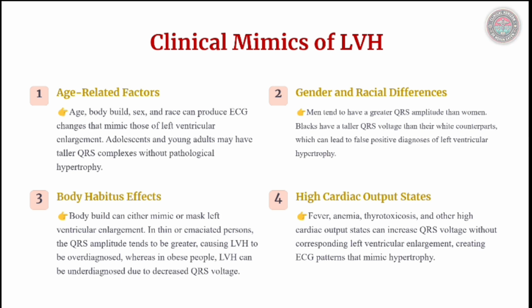Clinical mimics of LVH. Certain non-pathological conditions can mimic LVH. Young age, male gender, and Black ethnicity are associated with naturally higher QRS voltages.